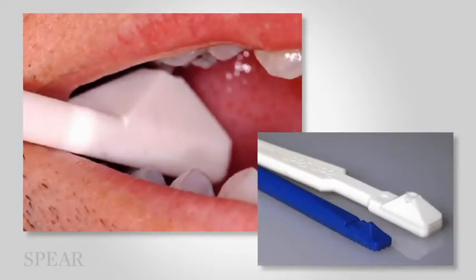And the reason for that is that the bite test is a function of pressure on the tooth that translates down to the apex. So you do get information about the periapical area, but the bite test is also oftentimes done with a bite stick or a Tooth Slooth, which can isolate a cusp. This way, pressure is followed by release, and that allows a little bit of cuspal deflection.